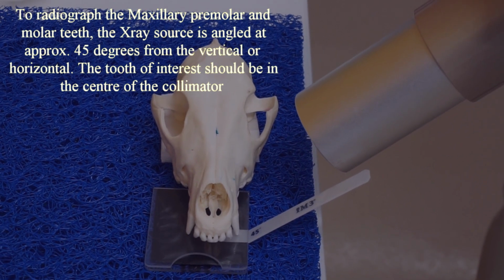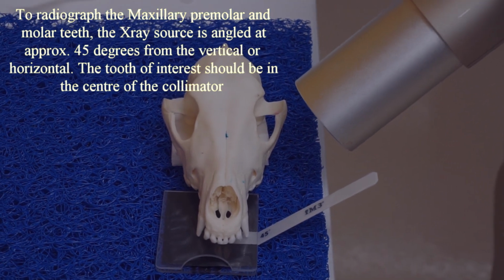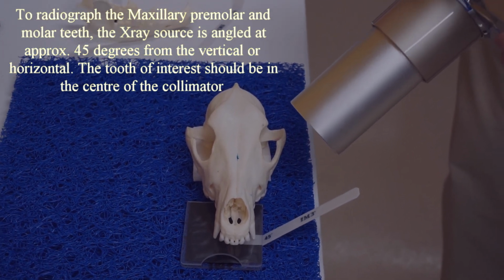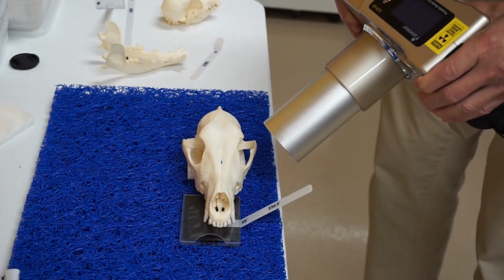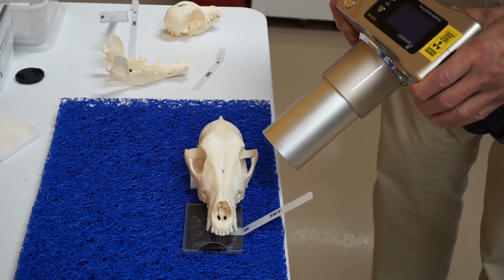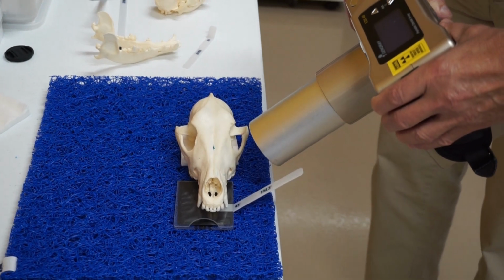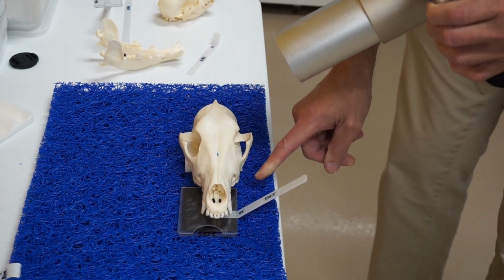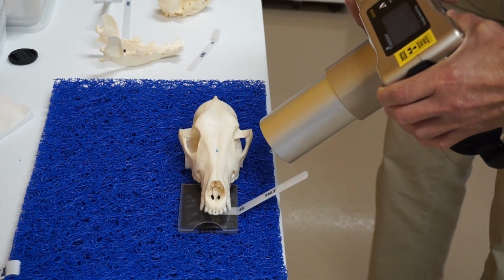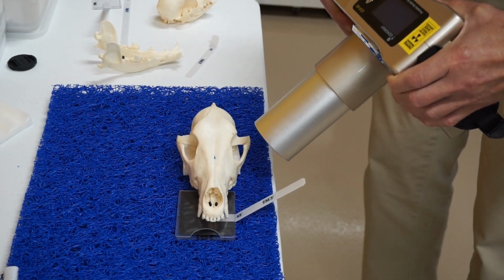If you're going to shoot the molar teeth, the same sort of angle, but because the molar teeth are going palatally a little bit, you're going to change your horizontal angulation to some extent. So you want to be at right angles to the tooth you're radiographing. So if you're radiographing the premolar 4, you want to be at right angles to that. What I mean by that is you want that in the centre of your beam at right angles to the collimator at that angle.